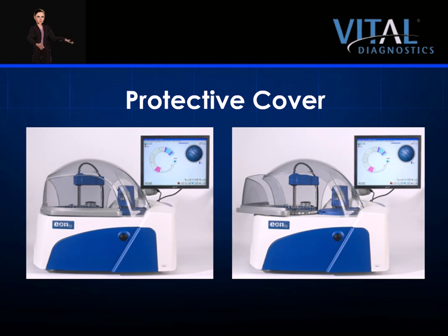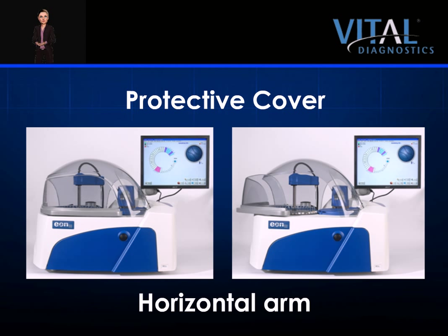The cover on the EON100 is designed for protection and functionality. It features a horizontal arm that swings open, allowing the operator easy access for loading and unloading reagents and samples. Opening the cover pauses the instrument without affecting runs in progress. The cover is constructed of a light, tinted plastic to reduce light exposure to sensitive reagents, and designed to create an effective chamber to reduce reagent evaporation.